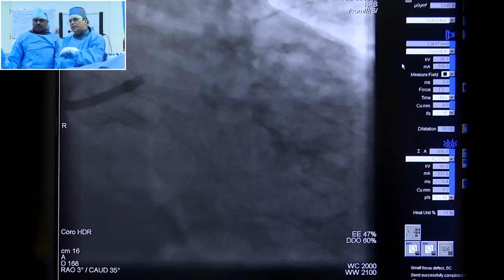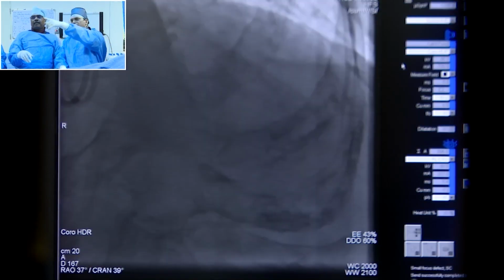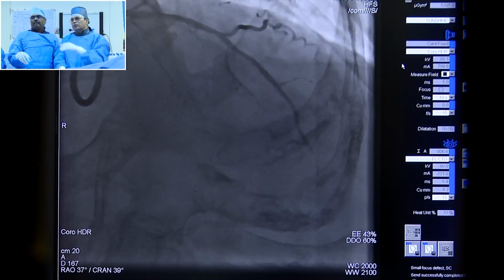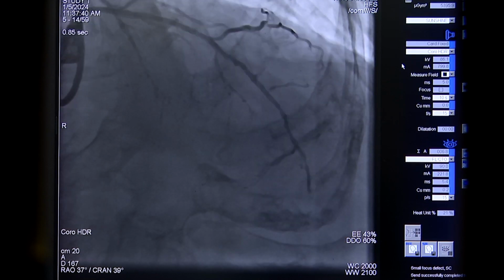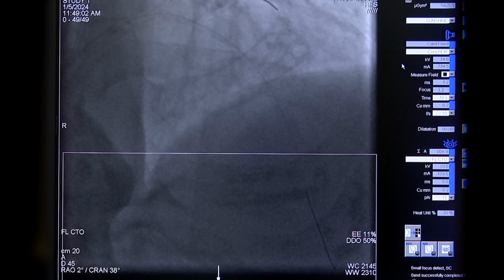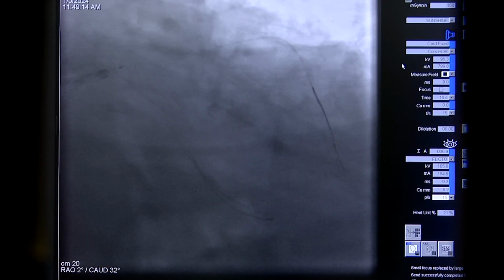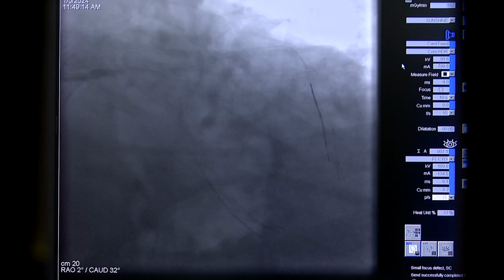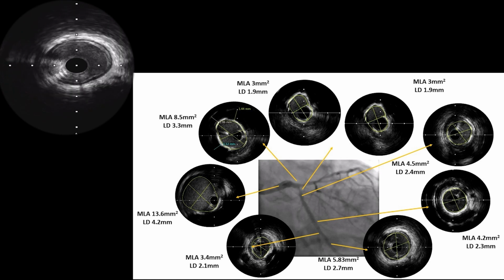Angiographically I feel he requires a 2-stent technique. We can see the distal LAD is significantly diseased, with a diffuse long segment lesion of the proximal to mid. Relatively distal LAD appears to be fine, but at the apex again there is significant disease. When you are passing the IVUS, are we able to cross with the IVUS catheter? That is very important. If we are unable to cross, you have to use the rota or orbital atherectomy, like an uncrossable lesion. Distally, there is no significant block.